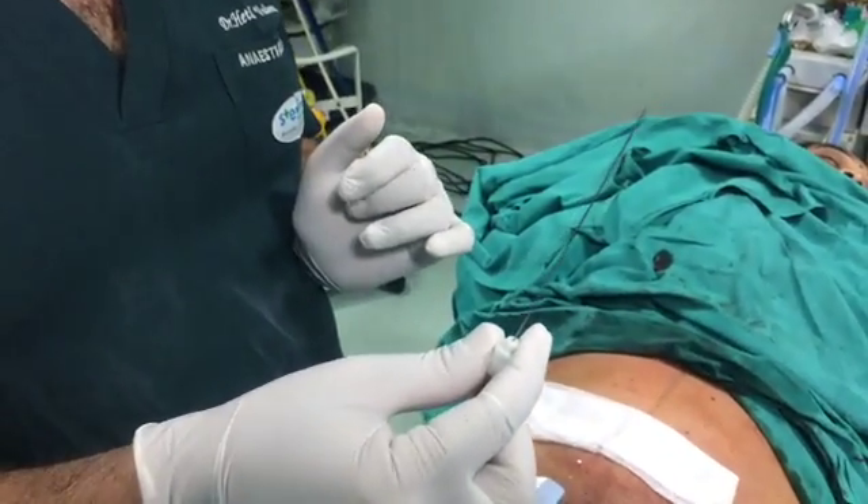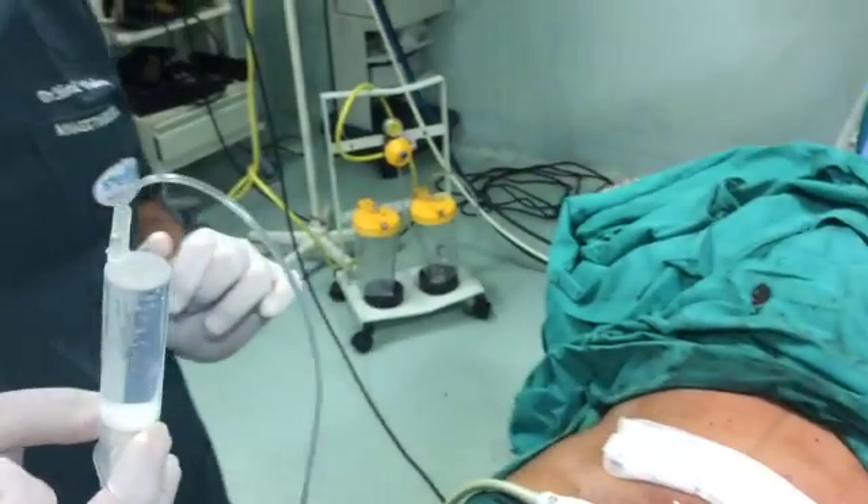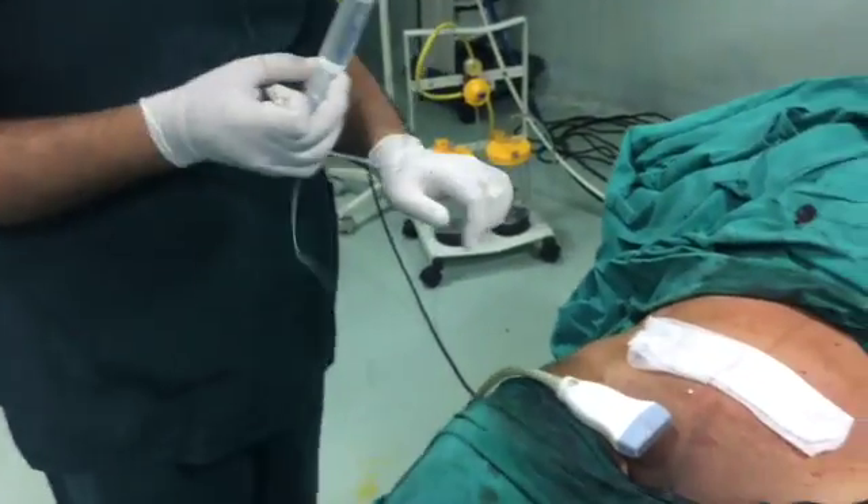Here I have set 3 cm, and I can increase it. I am using a 100 mm stimuplex needle. You can use a sonoflex, which is better visible. This is ropivacaine 0.25%, 20 ml.